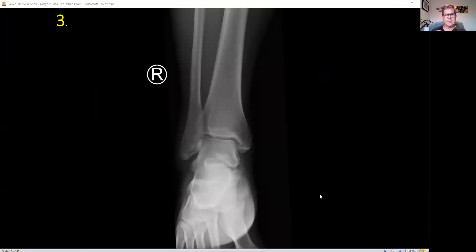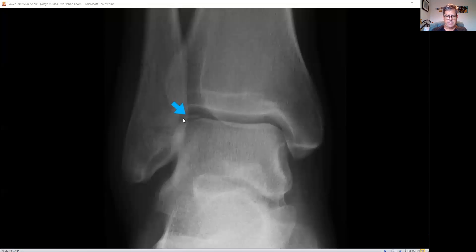Number three — this is tough. This person has a sore ankle. The places you look for a sore ankle: lateral malleolus, medial malleolus — can I see anything fractured? It is easier to miss, and this was missed initially. When you look closer, it's actually a mortise fracture. Surprisingly, this injury needs follow-up by orthopaedics and needs a CT or MRI to see how much damage is inside. People can get arthritis afterwards and sometimes need operative management. Worth giving a really good close look at your x-rays.